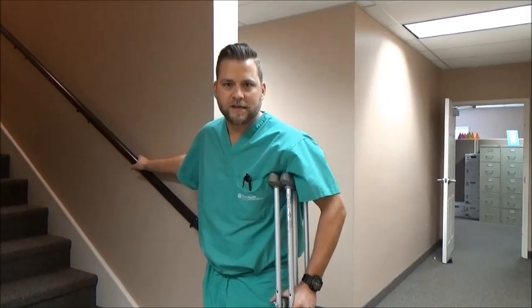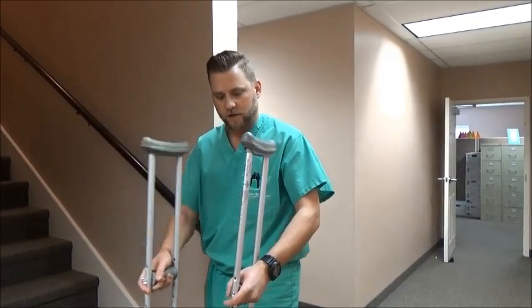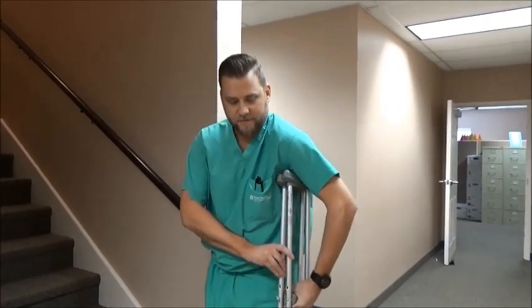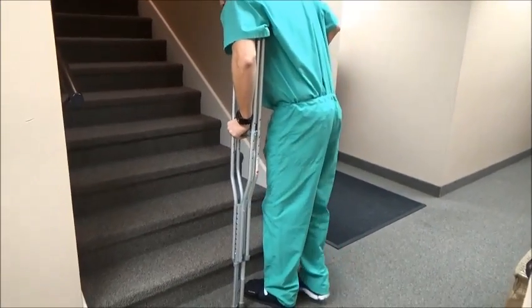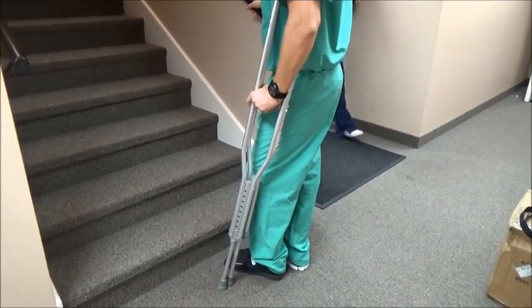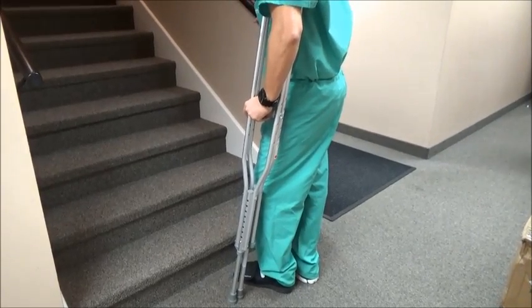The next challenge is going up or down stairs — it's very difficult to keep pressure off your foot. Put both crutches into one hand, usually on the same side as the injury, and grasp the railing with the other hand. The phrase to remember is "up with the good, down with the bad." When going up, you always start with your good foot.